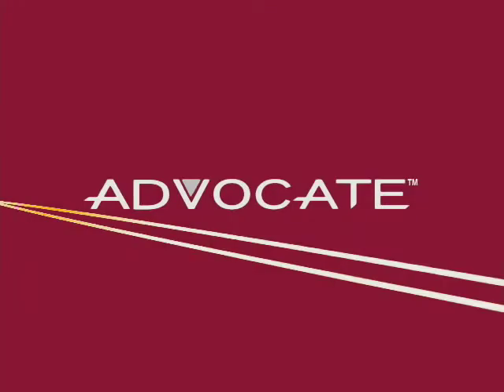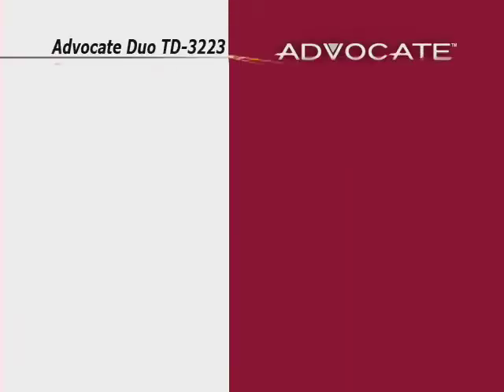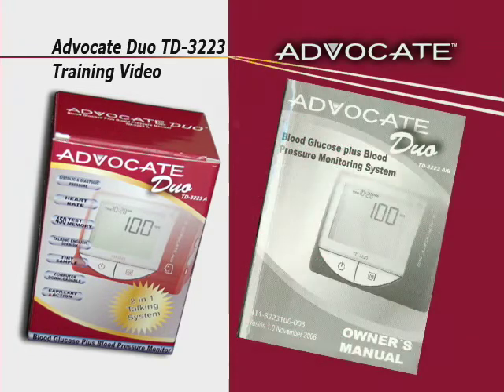As an Advocate system owner, you have chosen one of the best blood glucose and blood pressure monitoring systems on the market today. This training video in conjunction with the owner's manual contains important information about your system. While watching this training video, we suggest you use your owner's manual to follow along.